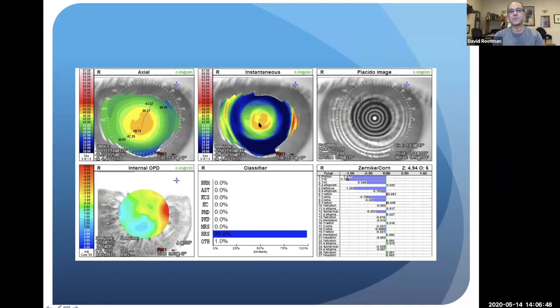You're looking probably 4 to 4.5 millimeters, and even less than that in the center. And what we're really doing is creating a very multifocal surface with a very small optical zone. So it's going to be susceptible to very small changes. In other words, if you're not perfectly on the visual axis, if there's a big angle kappa, that's going to induce not only astigmatism, but it's going to induce aberrations as well.